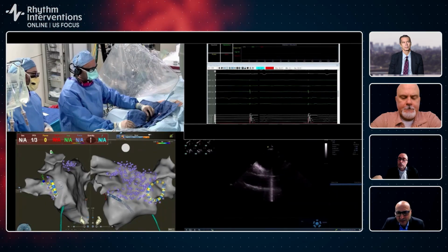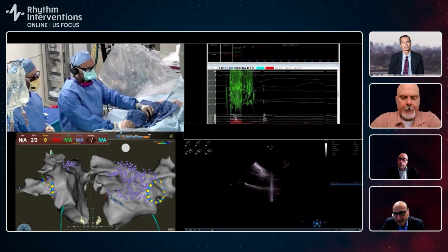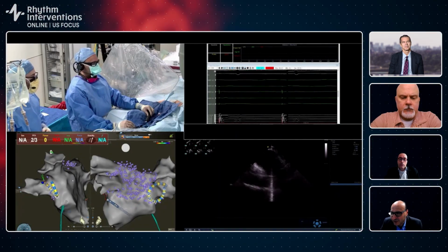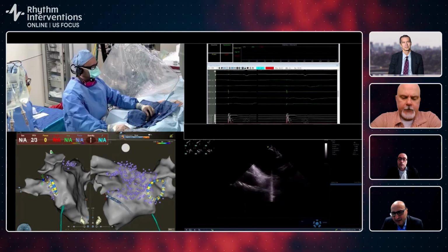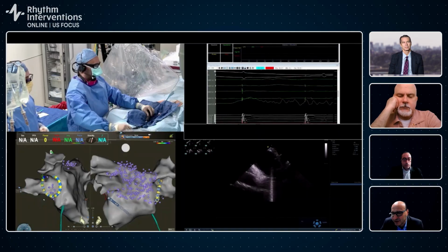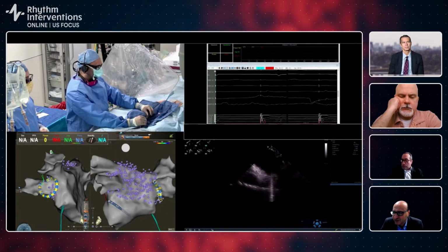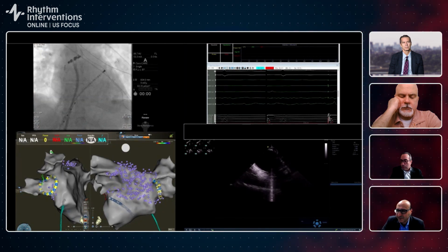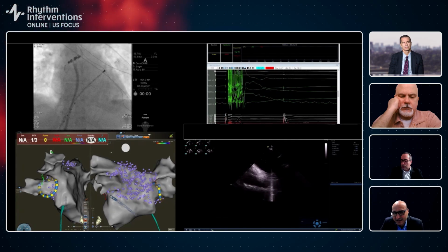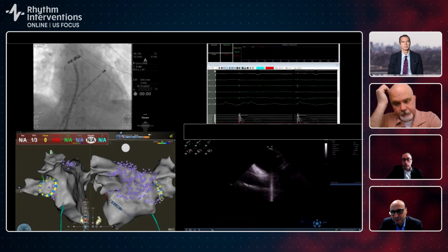Yeah. So, we know pulse field ablation does not cause injury to the pulmonary veins. And I just don't like ablating in a place where I don't need to ablate. So if we want to pick one of those things that I usually think about, it's probably hemolysis. I watch the number of ablations that I deliver carefully. And also when you have a catheter deep inside the vein, I'm not sure if you get any more heating than you would get from a proximal place. So it's not a place that I needed to ablate. And again, this catheter, you can use it.